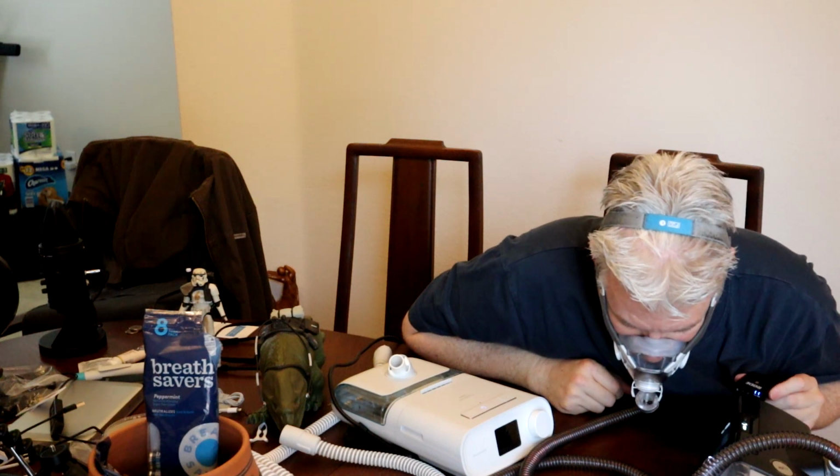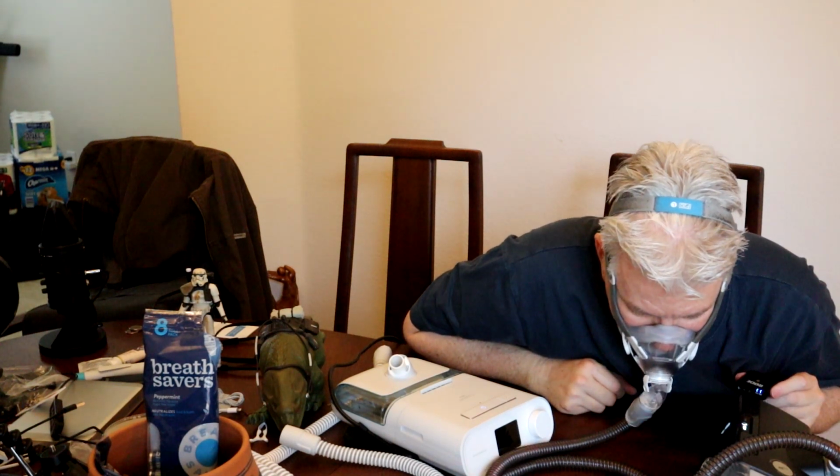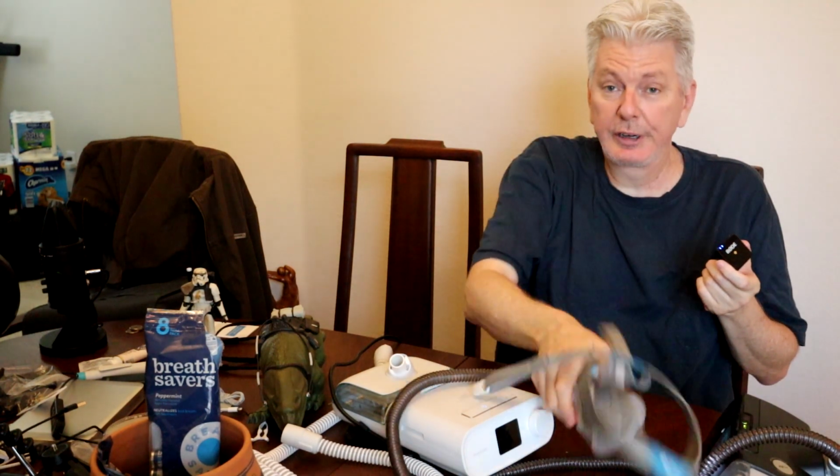So here's the ResMed. I put this on, and they both start automatically. And that's it. It doesn't get any louder than what that was, and that was nothing. So you put the mask on, and you just start breathing. After almost 2 breaths, it kicks in and automatically goes. And then after whatever the ramp setting is, about 10 to 15 minutes, it starts to ramp up gradually, and then it gets up to your maximum pressure.